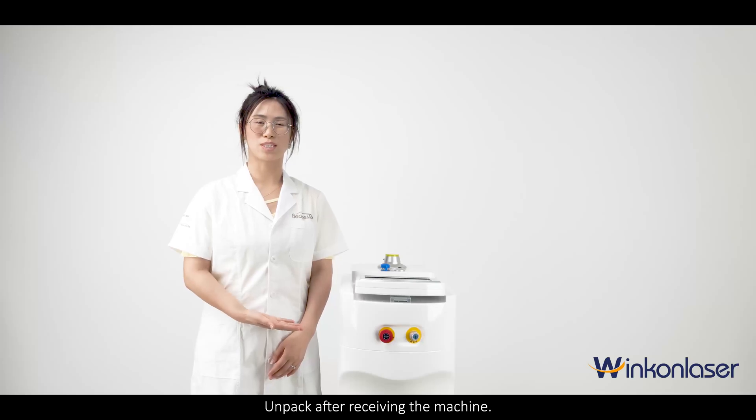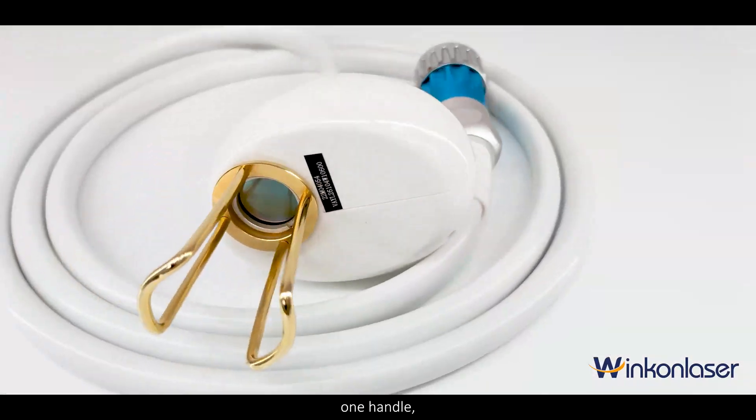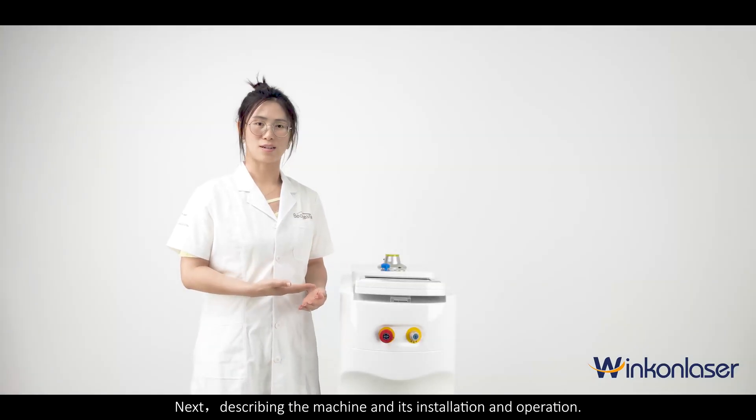Unpack after receiving the machine. It contains one machine, an accessory box, one handle, and a pedal. Next, describing the machine and its installation and operation.